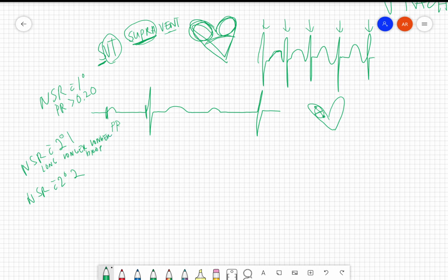Longer, drop. So what happens is we've got a P wave, Q. I'm going to leave my T waves off for this demonstration because it's already too much for me to remember to draw. So we have an isoelectric line, we've got a P wave, and we have a QRS, and it looks normal. And then we have a P wave and a QRS, and I'm leaving off the T waves, remember. Then I have a P wave, and a really long one, and then a P wave, and then nothing, and another P wave and a QRS, and a P wave and a QRS. That's really ugly. Okay, so the point is it's long, longer, even longer.